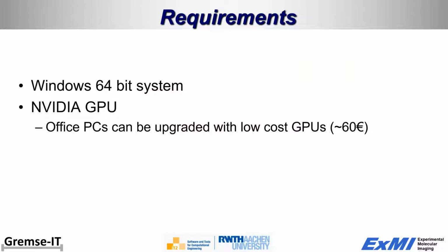The requirements are a Windows 64-bit operating system and an NVIDIA GPU. Fortunately, almost any office PC can be upgraded with a low-cost NVIDIA GPU for around 60 euros. Those are small and they fit into almost any PC.